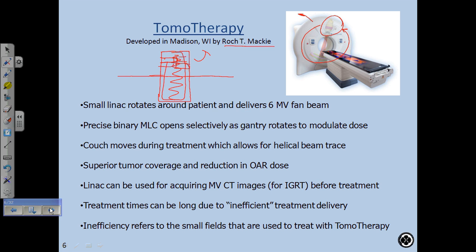The way the treatment planning works is you do your treatment plan, put in your constraints, put in your CT scan, and then the cluster, when this started, would have to work overnight to calculate all the fluence inside the patient. Once it did the pre-calculation, the next day you could do the iterative planning and modify things.